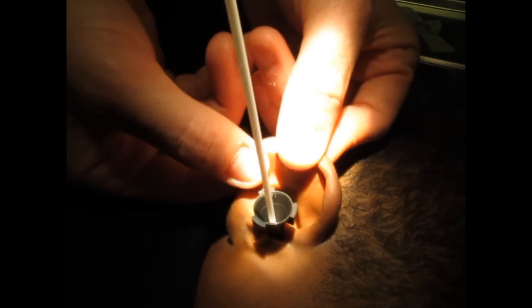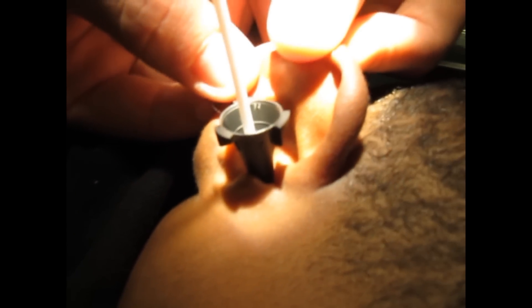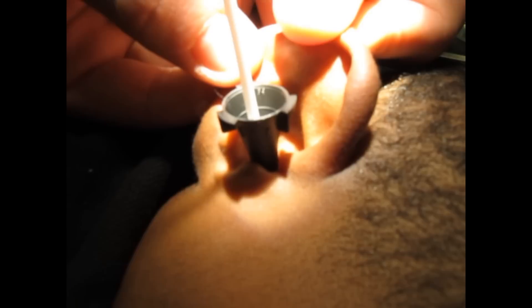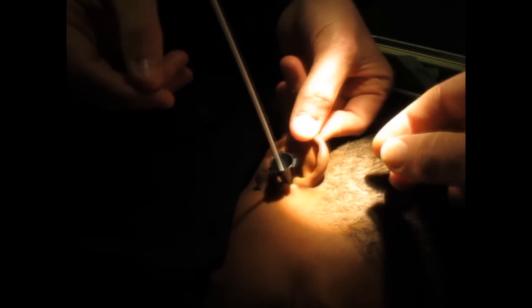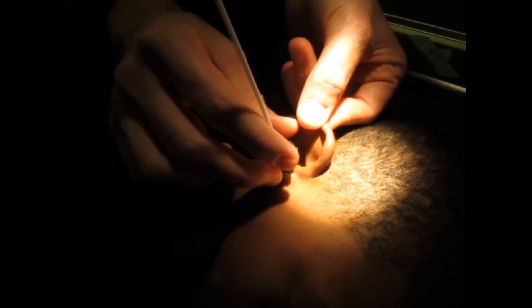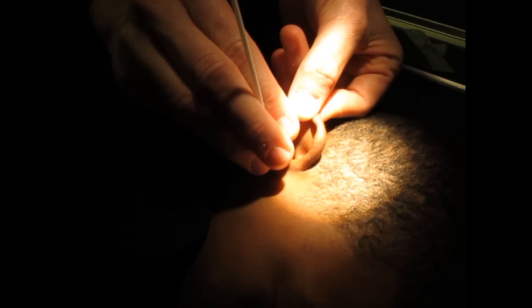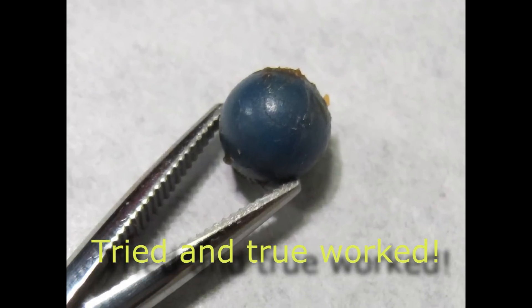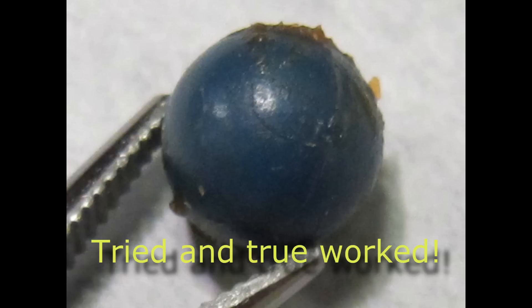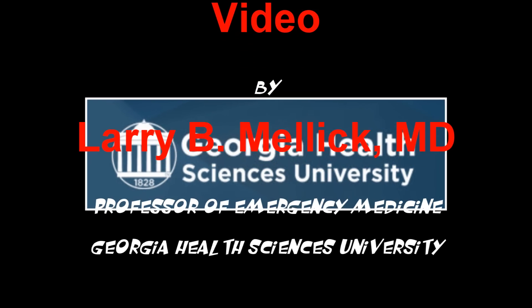We've put the Dermabond on the tip of this swab and we're holding it, stabilizing it. Do you want me to hold the ear? I think I can do this one. You can try and take that speculum out first if you want. The child is resistant, repeatedly saying no.